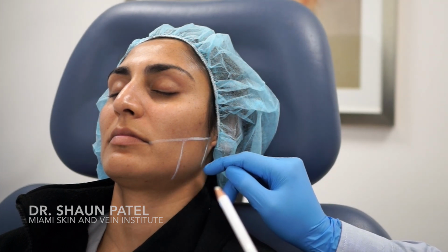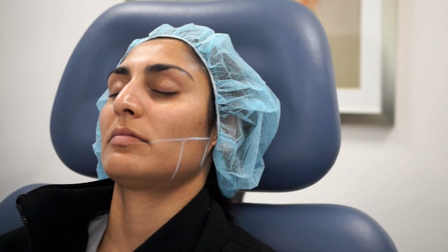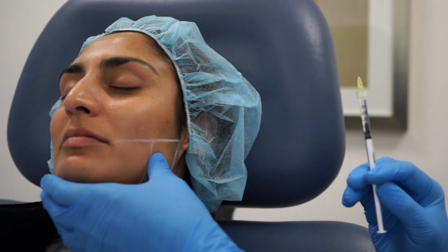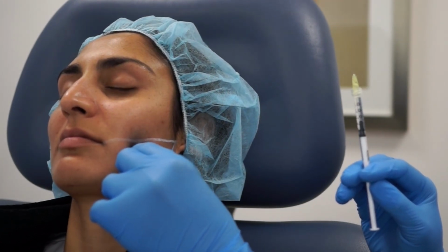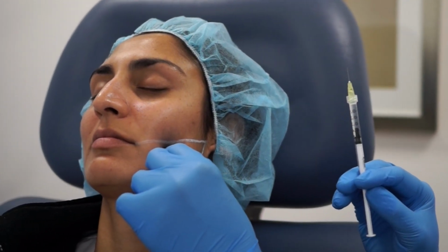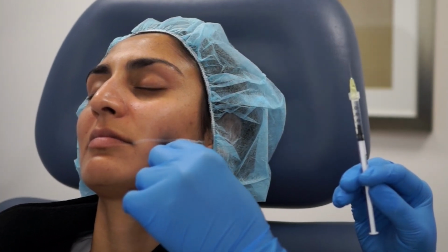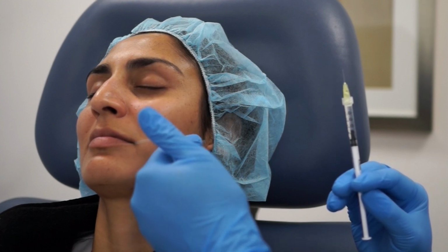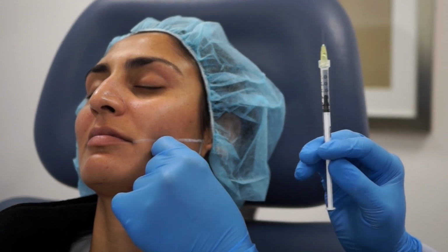So now that we've marked the skin, I'm going to prep the skin with alcohol, and then we'll proceed with the injections. Skin has been prepped, and I'm asking her to bear down, Angie, so I can feel the muscle. And then it's really not a very targeted muscle. You do want to go relatively deep because there are relatively deep fibers of the masseters, and if you only inject the superficial fibers of the masseter, you'll get some outward bowing of those deeper fibers, giving a somewhat odd look to the angle of the mandible.